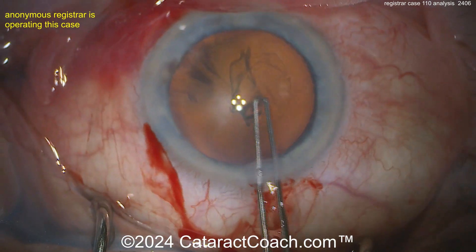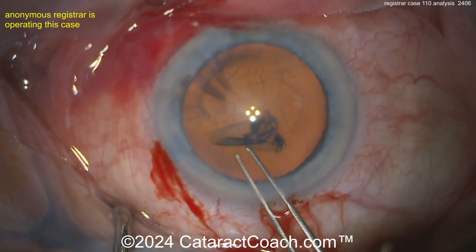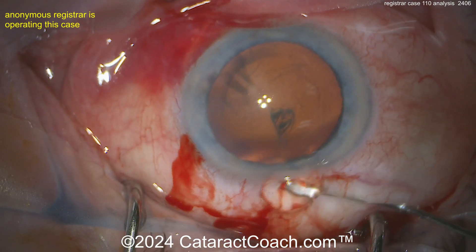Now let's see the rhexis — that's pretty good. That's a really nice-looking rhexis for case 110. My friend, you're doing a beautiful job; that's a fantastic rhexis, and the incisions look pretty good too.